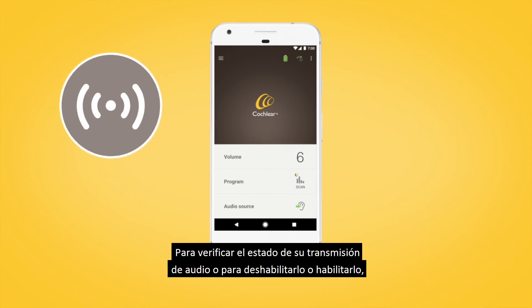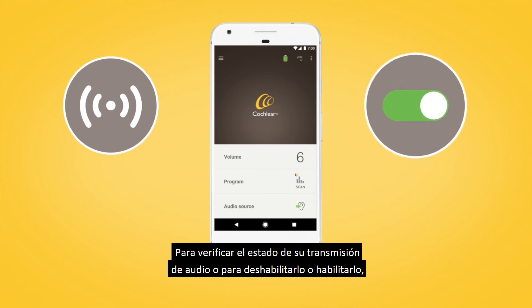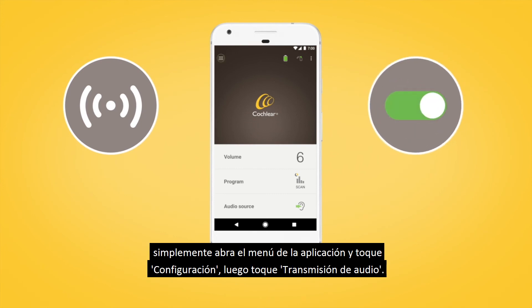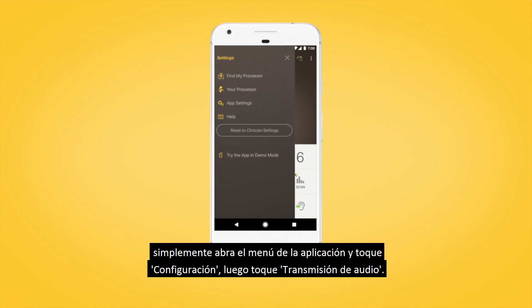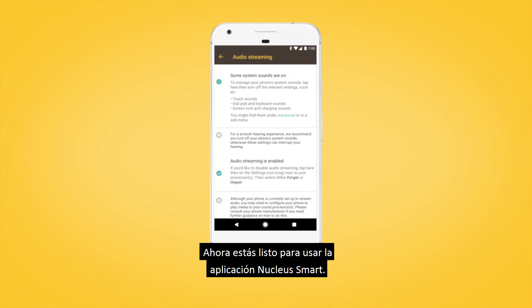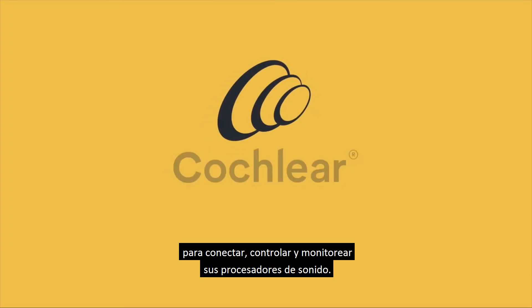To check your audio streaming status or to disable or enable it, simply open the app's menu and tap Settings, then tap Audio Streaming. You're now ready to use the Nucleus smart app to connect, control and monitor your sound processors.